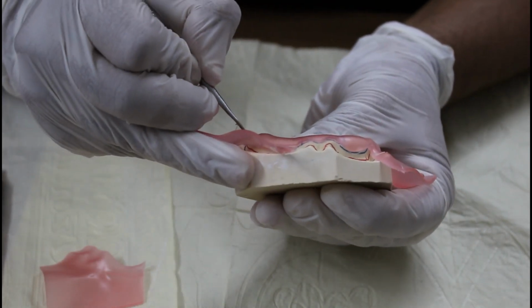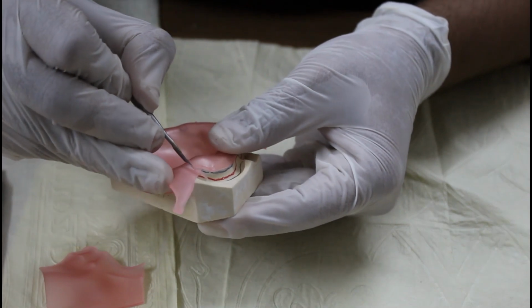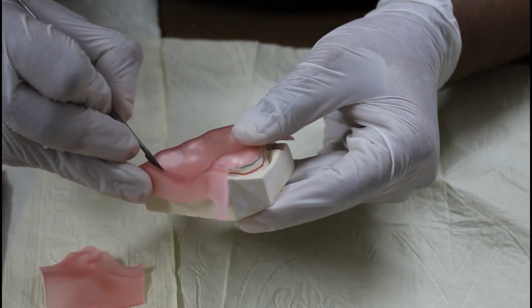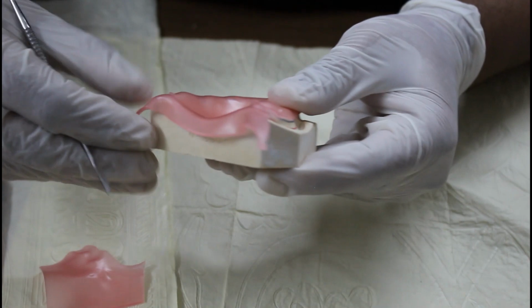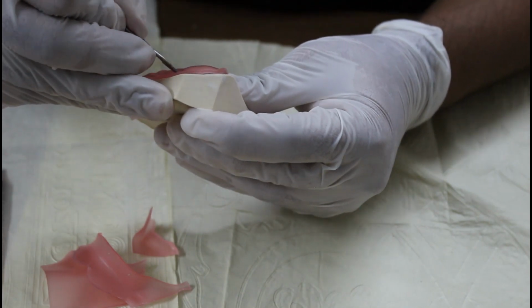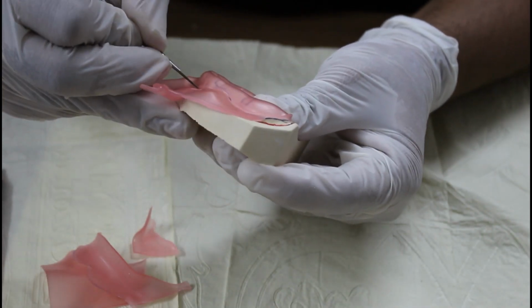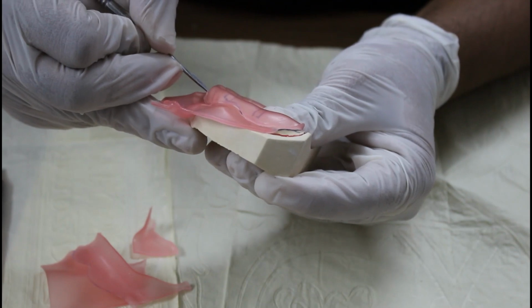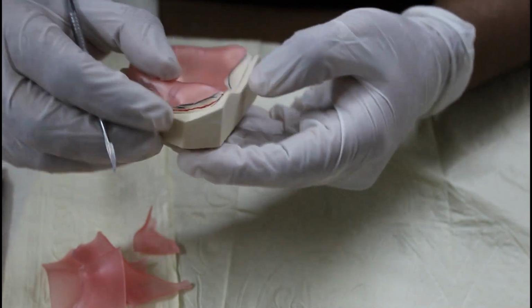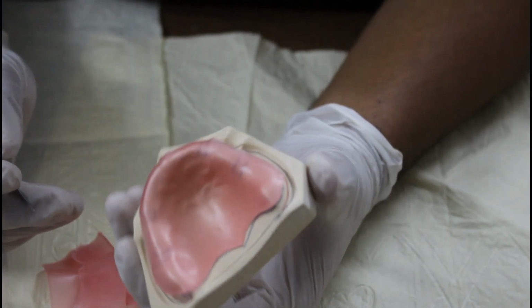So I will now cut it for you. Now this is your spacer made up of wax.